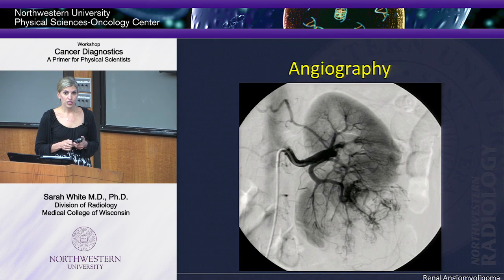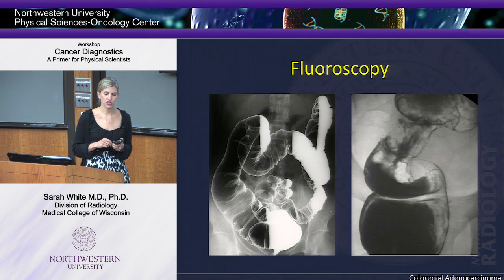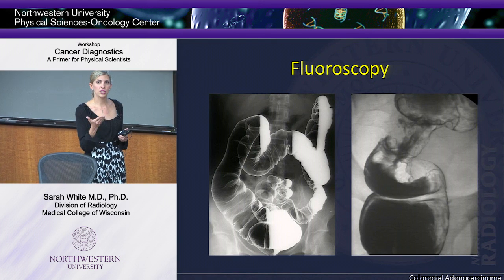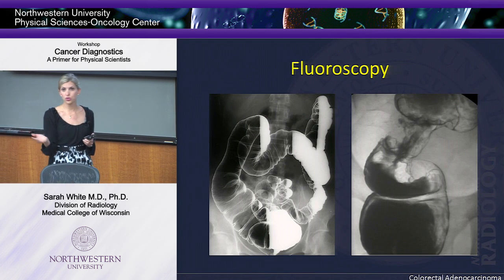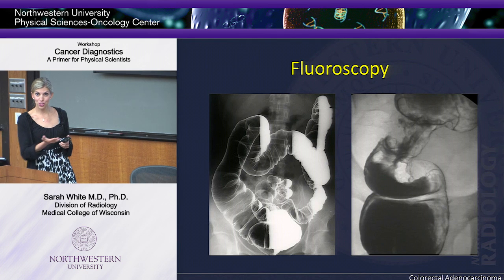This is angiography, okay? So angiography is basically taking, I'm going to flip to fluoroscopy for a second first. So fluoroscopy is basically you have X-ray and you just have a pedal, and that X-ray is going to be continuous. Okay? You can take a picture, and you can stop and take a picture if you want, but basically what's happening is you're just continuously having X-ray. So you can move your hand in and out of the beam, and you can see your hand moving.